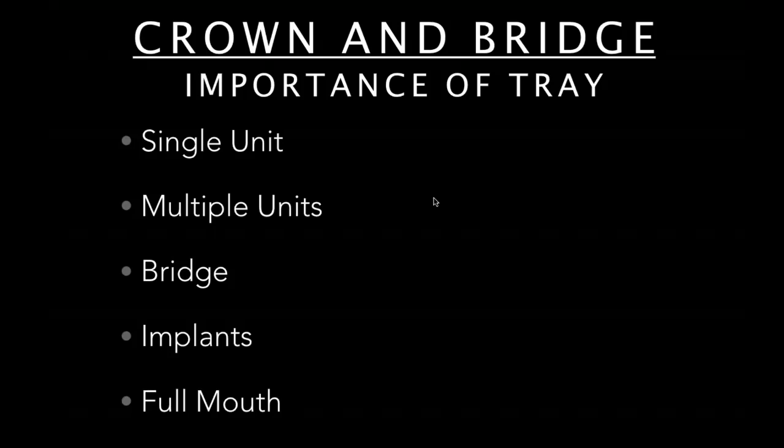And that's the distortion. A lot of times also we will take a bite after we take the impression out to send to the lab. Multiple units, we use full arch trays. There's no question. Single units, again, we can talk about, we can use fast set, but multiple units, we want to use a regular set, the 4-minute set. In bridges also. With implants, I use regular set, and of course full mouth, same as multiple units. We use full arch trays for all those, just because you should. Just take the time so that they can articulate the model properly. And it saves you a lot of time when your lab technician has a properly articulated model to give you a good restoration and occlusion, so that you don't spend a lot of clinic time adjusting that bite.